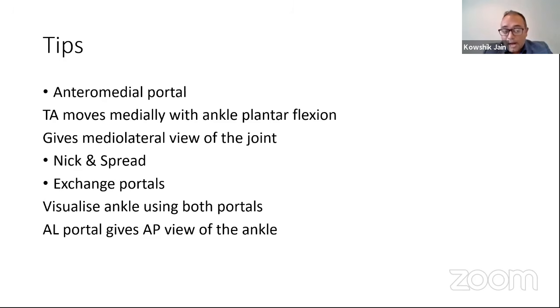Anteromedial portal marking is preferably done before the distractor is applied. This is because when you put the non-invasive distractor on the ankle, invariably the foot goes into plantar flexion because there is force pulling on the foot down. There is a distracting force which is pulling on the foot. So your foot invariably goes into plantar flexion.